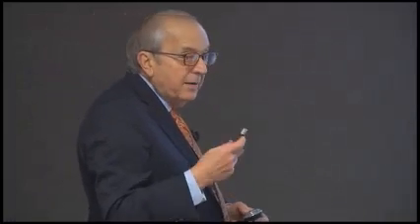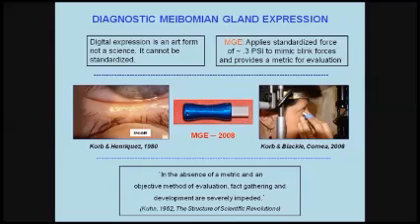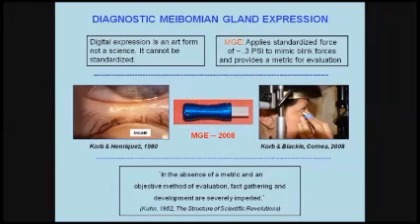As a result, starting in 2005, we embarked on a program to understand how much force was needed on a gland. And we found out that we needed about 1 gram per square millimeter of force to really get a gland to secrete in the same manner that it would if there were a forced blink. So if we shut our eyes and squeeze just a little bit, that's about 1 gram per square millimeter, or 0.3 psi. And we developed this device which applies a standardized pressure, and you apply this right underneath the eyelashes, just as that thumb is.